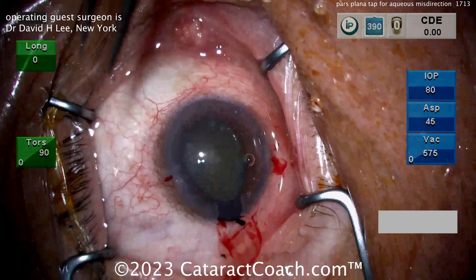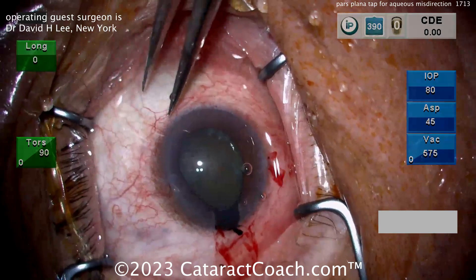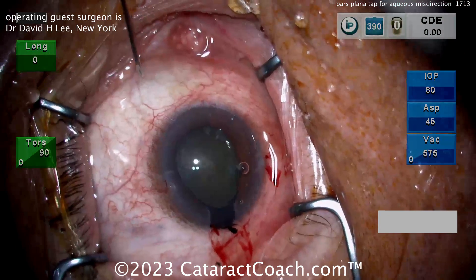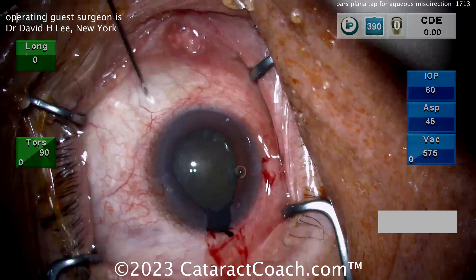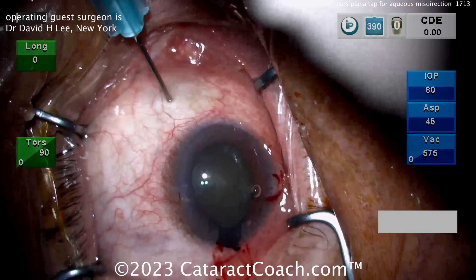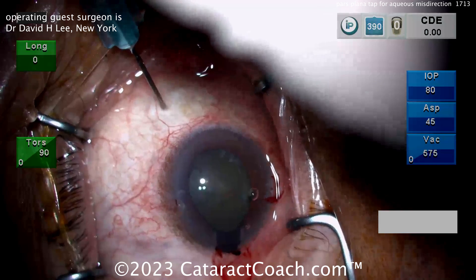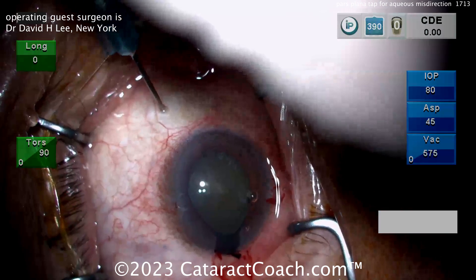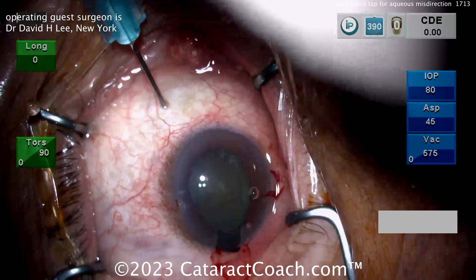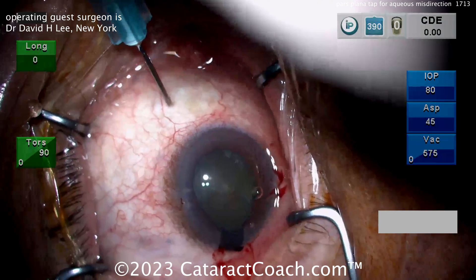Getting a good idea of where you're going to do this — zoom out a little bit — and then taking that needle and aspirating some of the fluid out. You don't need to aspirate a ton of fluid; it may be just a fraction of a cc. You may need extra anesthetic if the patient is under topical anesthesia only. You also sometimes want to mark the needle itself so you know how deep to insert it. Aspirate on the plunger and that will take out the fluid that's accumulated. You can also do this with a pars plana anterior vitrector, just doing little bits at a time.